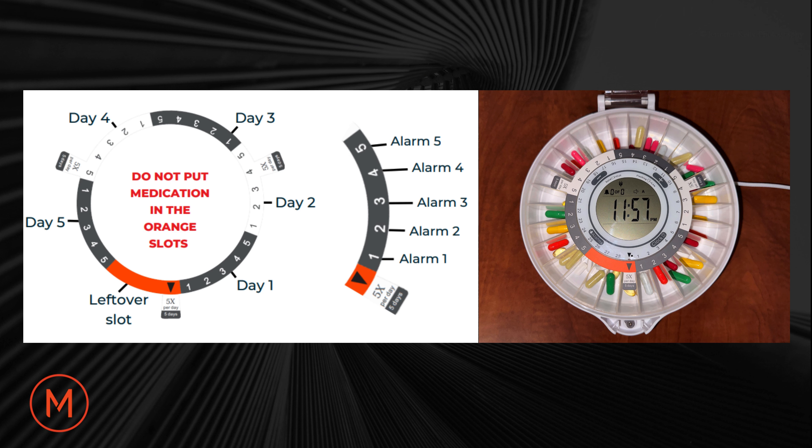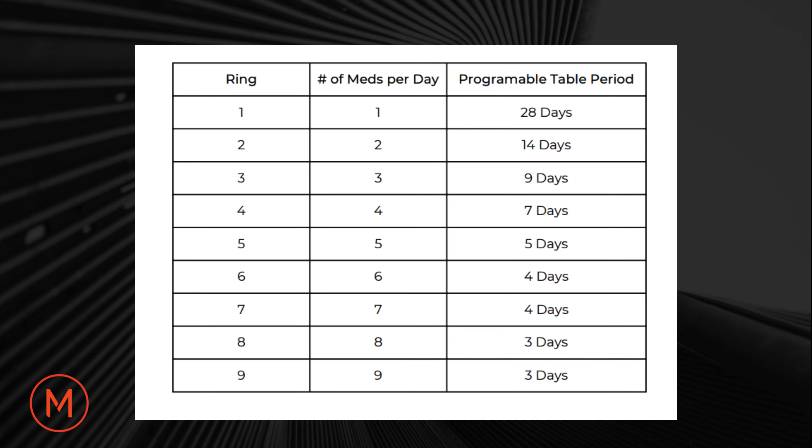The pill dispenser includes nine daily dosage rings. The daily dosage rings correspond to how frequently medication needs to be taken on a daily basis. In this photo example, five medications are consumed per day, which will accommodate five usage days or 25 total doses. This daily dosage ring table will show you how often you need medication dispensed daily, indicating how many medications will be dispensed and the number of days before having to refill the compartment.